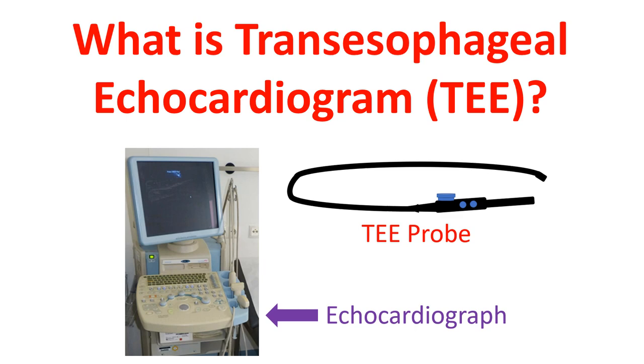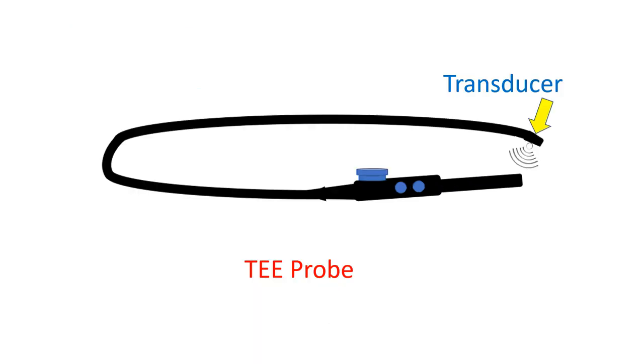Echocardiogram is an image of the heart using ultrasound. An ultrasound beam is transmitted into the body using a device known as a transducer. The echo received from the body is processed by the computer in the machine to give a moving image of the heart.